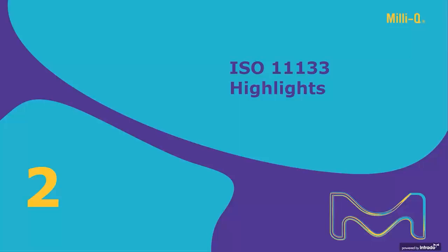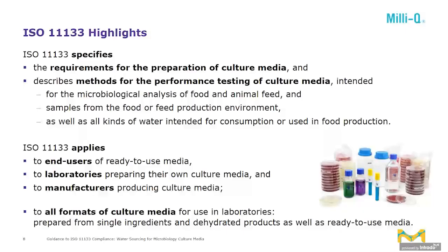Some highlights from the ISO 11133. The ISO 11133 specifies the requirements for the preparation of culture media and describes the methods for the performance testing of those culture media for microbiology intended for the microbiological analysis of food and animal feed and samples from the food or feed production environment, as well as all kinds of water intended for consumption or used in the food production itself.